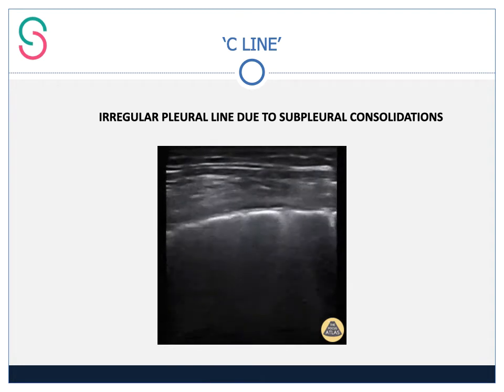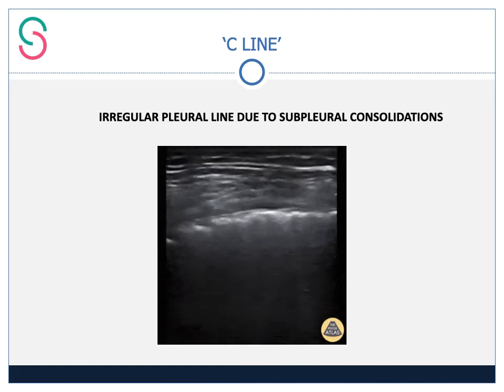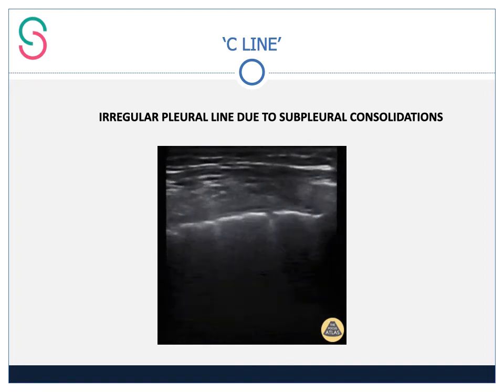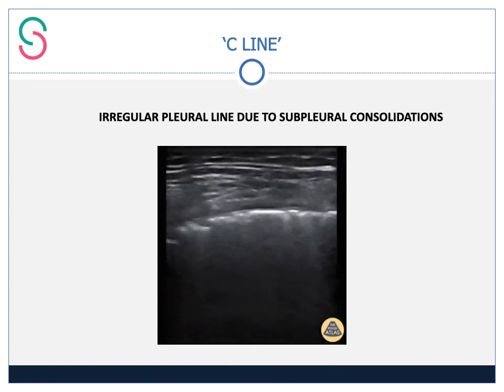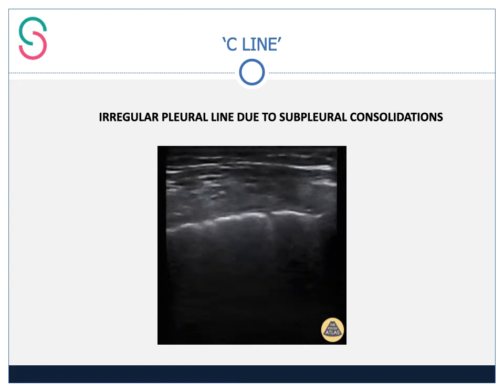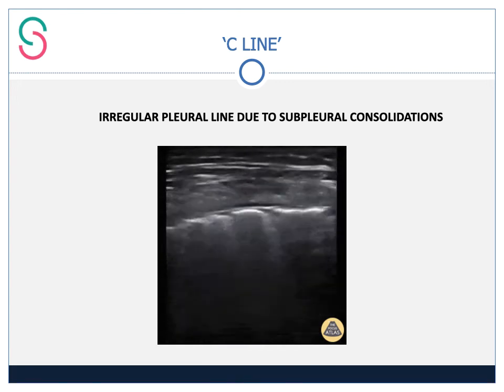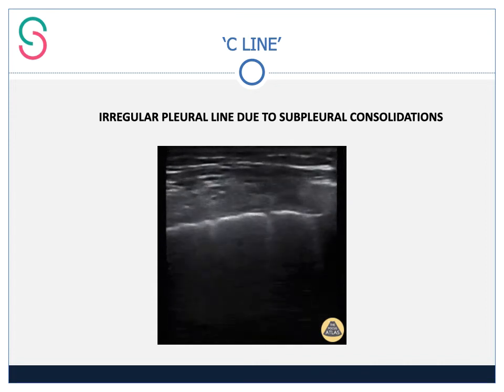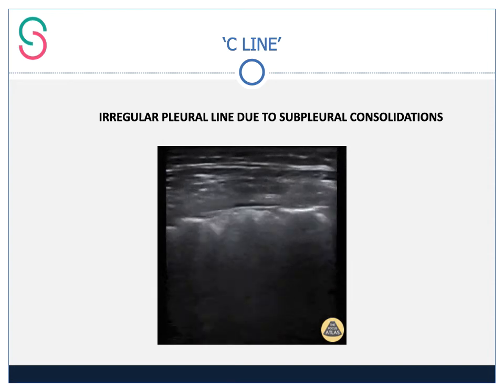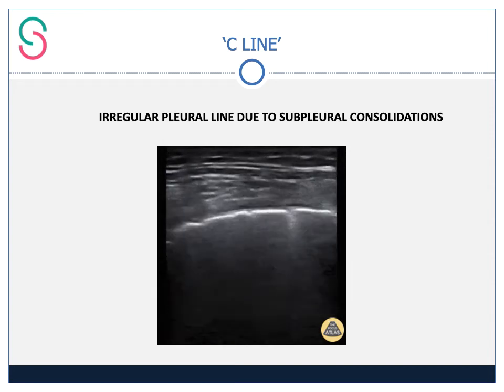And this can be an indication of, again, multiple pathologies, including COVID-19, types of pneumonia, pulmonary infarcts. It can also be seen in lung fibrosis. So it doesn't specifically point at one particular diagnosis, but is a feature of many conditions. And you'll have to use additional imaging and clinical findings to come to a diagnosis.